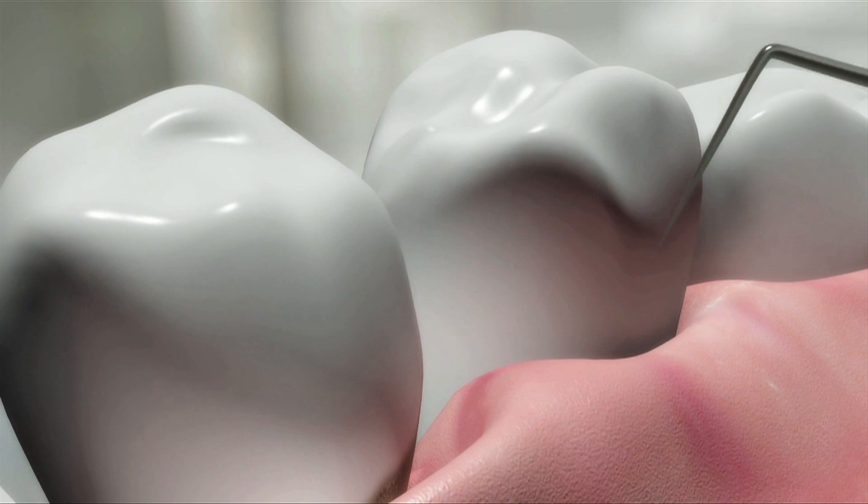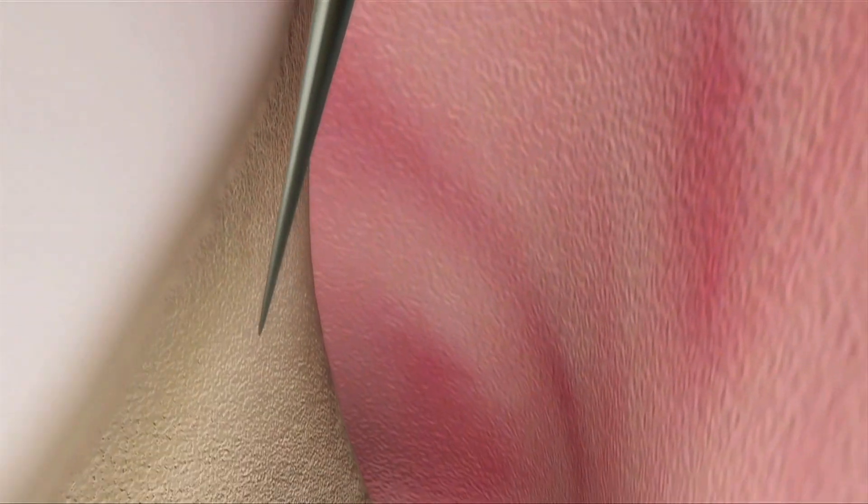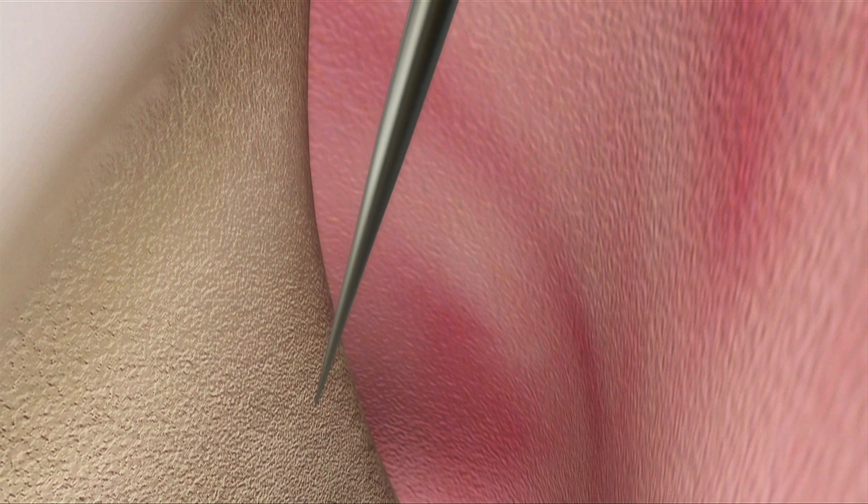Next, we use an endodontic explorer to confirm tactically that all the calculus has been removed. If any calculus is remaining, the Erbium YAG laser is used to remove it.